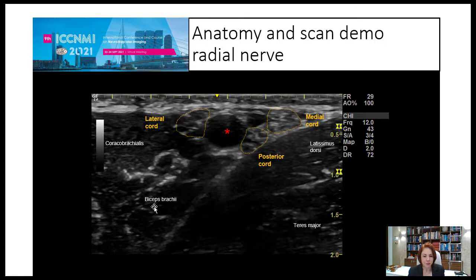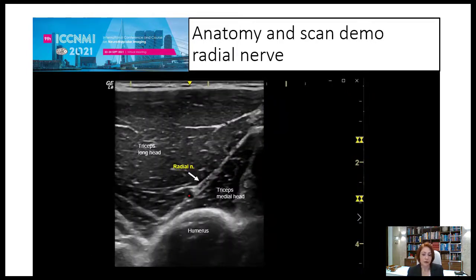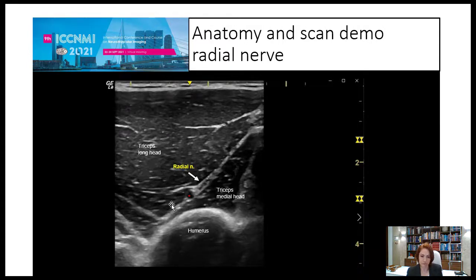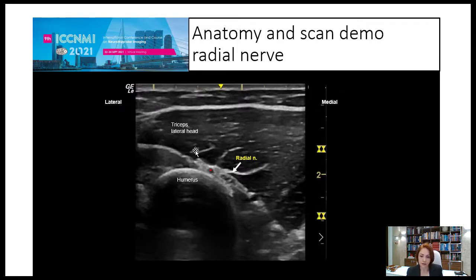The muscle landmarks here are coracobrachialis, biceps brachii on the lateral side, and latissimus dorsi and teres major on the medial side. Going down, the nerve descends close to the medial head of the triceps and the humerus, behind the long head of the triceps muscle. It then winds around the humerus from medial to lateral side along with the deep brachial artery, beneath the long head of triceps medially and the lateral head of triceps laterally.